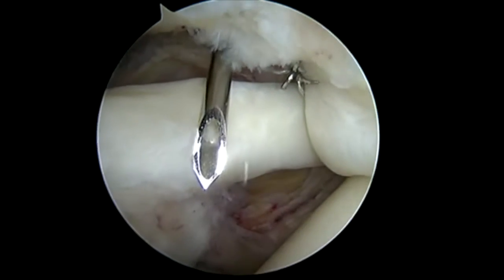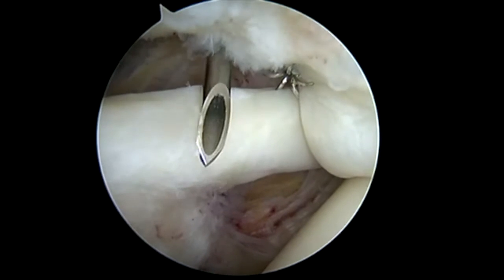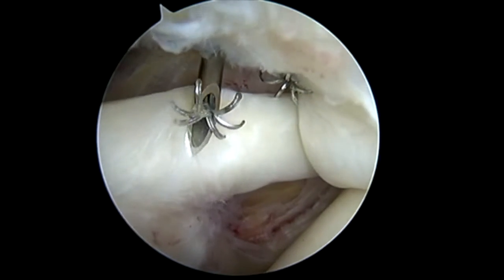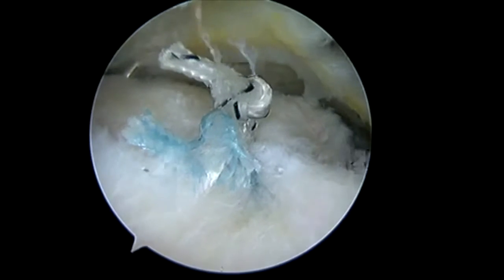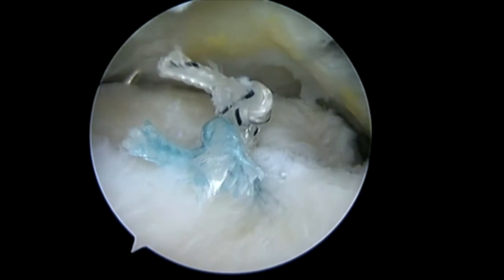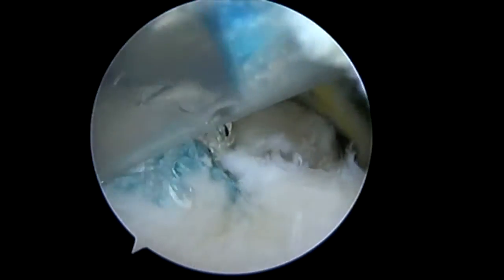Here we're introducing our biceps tendon markers. These are spinal needles with deployment hooks that allow you to accurately mark your biceps tendon. This is very important so that you do not place the graft onto your biceps.